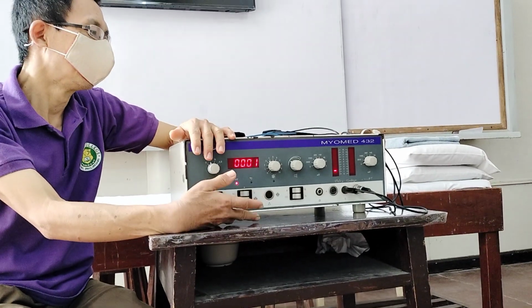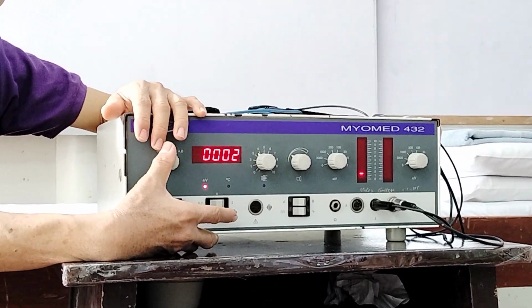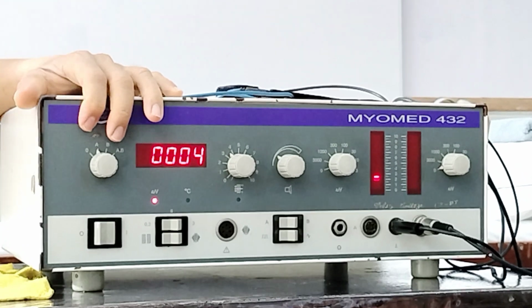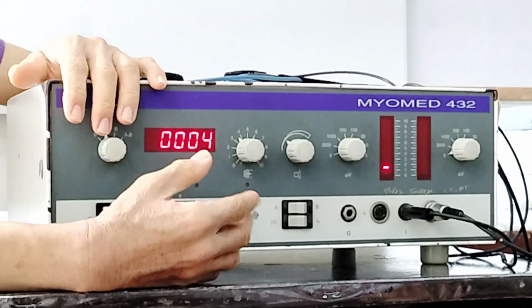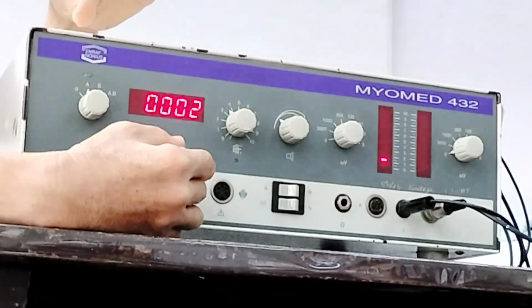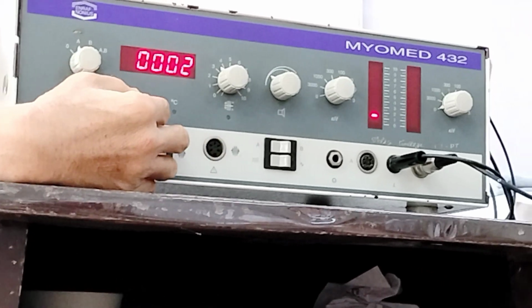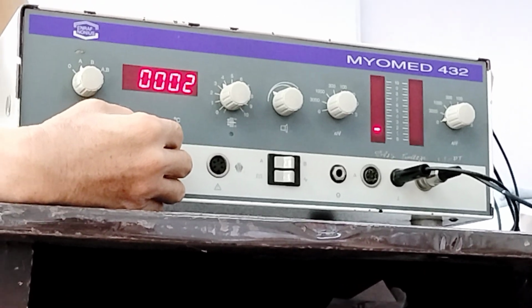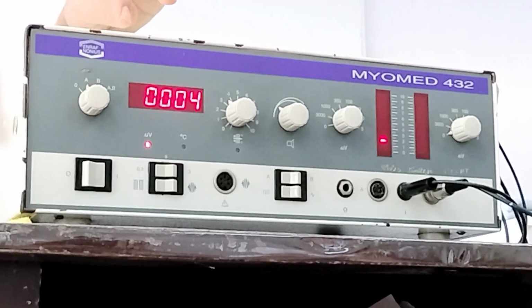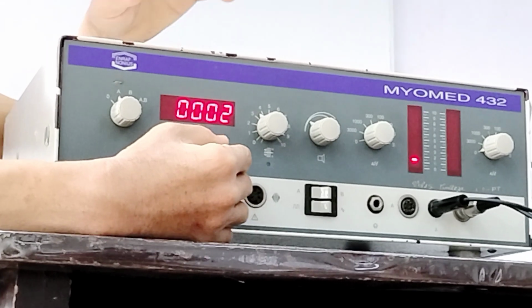Yeah. Okay, so with regards to the machine, not all machines would look like this. You can even see this one, there's still a biofeedback for this. You have even seen those videos that I have shown or shared during the lecture of portable devices. There are even some tablets, gadgets, like apps there that you're going to download. So you have several of these devices.